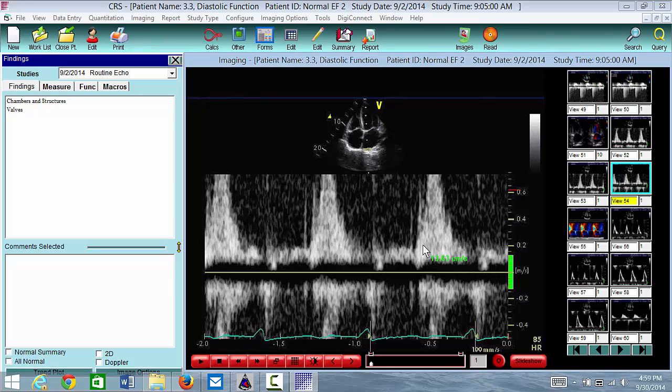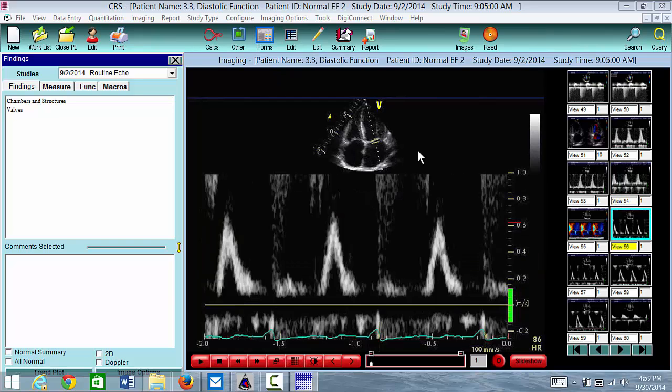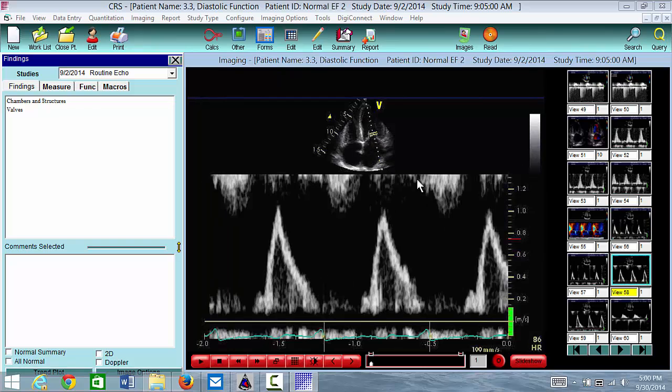You could illustrate that they have a high diastolic pattern, I don't see any sort of a systolic pattern. Maybe, and you can't really comment on an A-wave reversal. And then this is at the annulus, so you want to make sure that you get the leaflet tips.